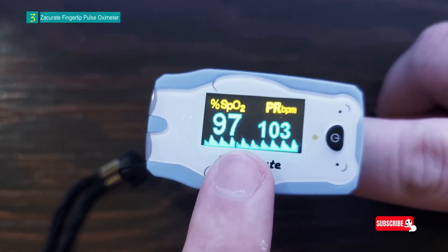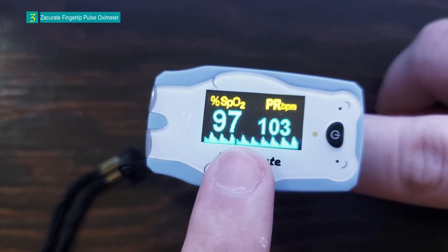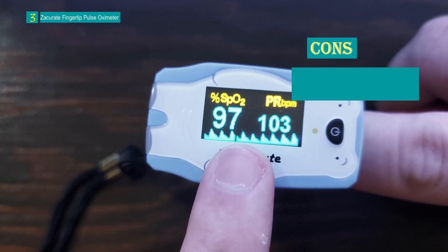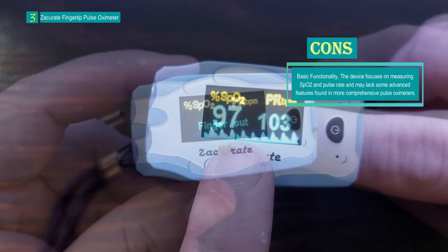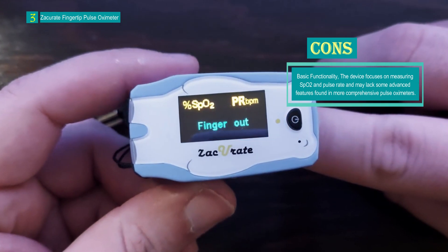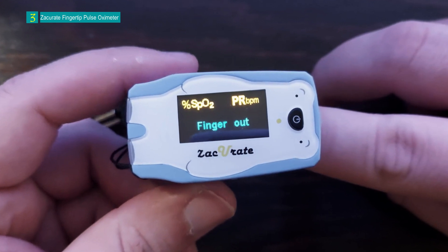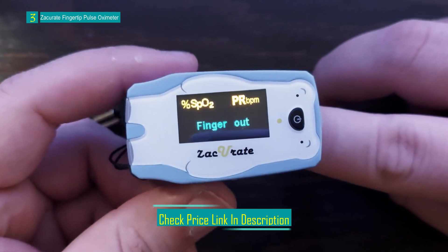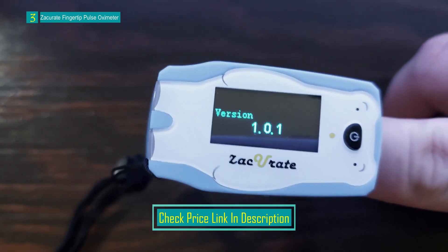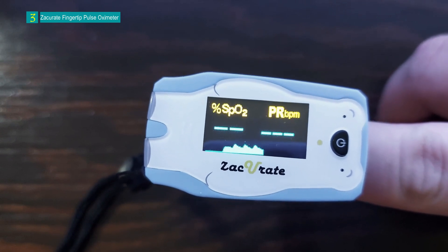The Zaccurate Children's Digital Fingertip Pulse Oximeter is an excellent tool for parents and caregivers who want to monitor the vital signs of children, teenagers, and adults with small fingers. Its attractive animal design and adjustable OLED brightness make it appealing and user-friendly. Plethysmograph Waveform Technology enhances the accuracy of readings, and the multi-directional display adds convenience. While basic in functionality and not suitable for infants, it provides a simple and effective way to monitor SpO2 and pulse rate.